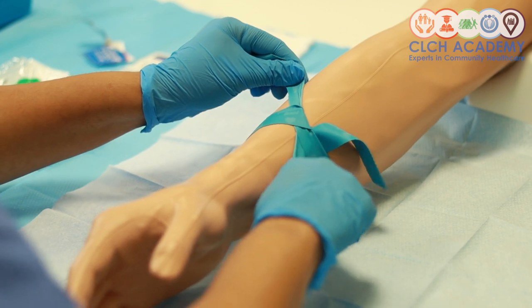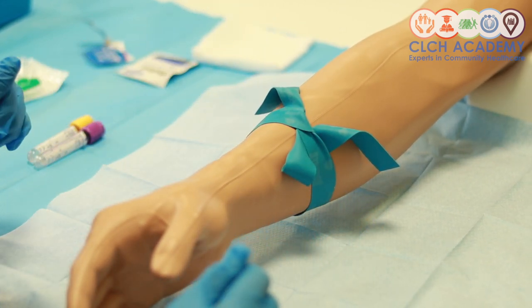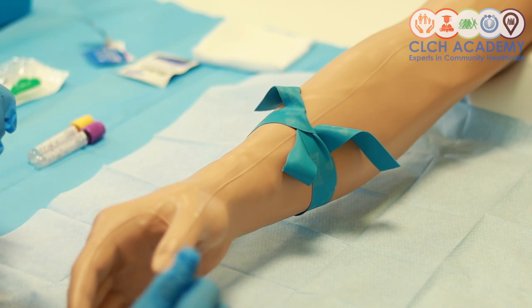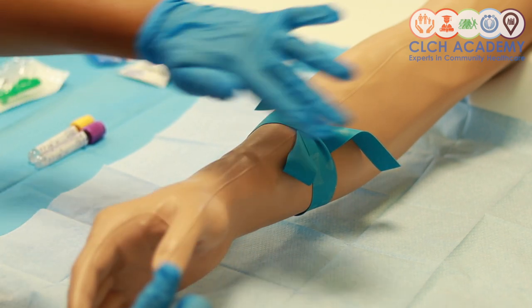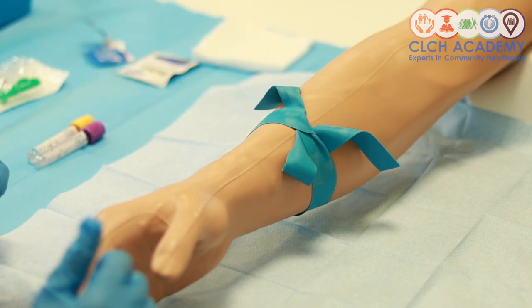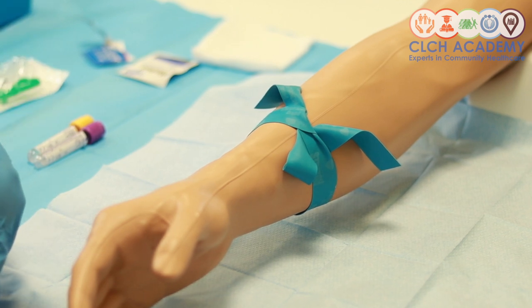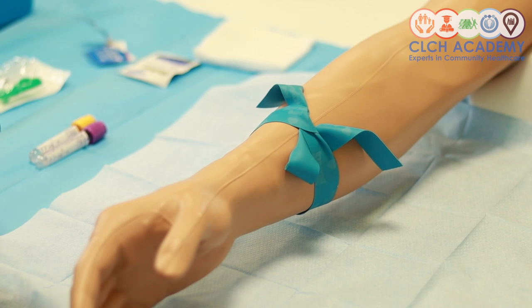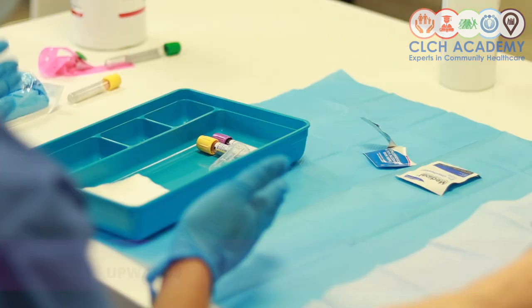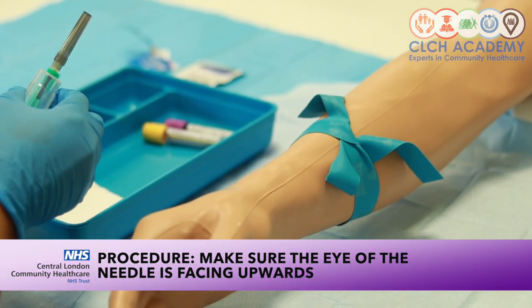And then I'm going to create a loop with the long end and tighten using the short end. That ensures that my tourniquet is on tight enough. However, my tails are facing away from the area that I will be working on, and I just have the light loop coming downwards. This means that it's not contaminating the region that I'm going to be working with on the patient. My tourniquet is now applied. Now we're ready to proceed with our blood collection.